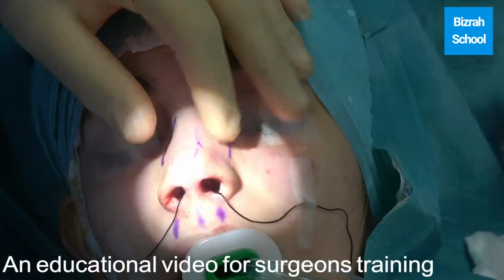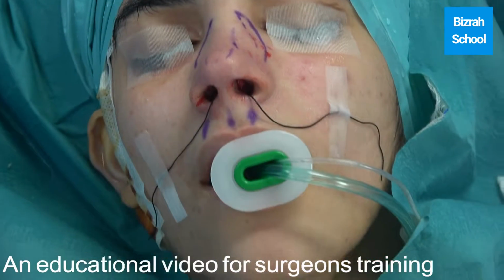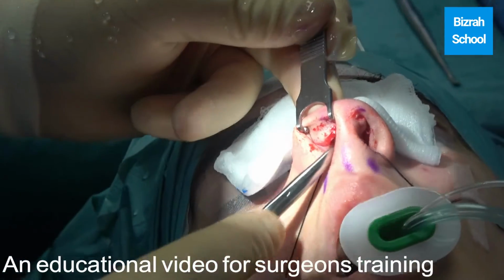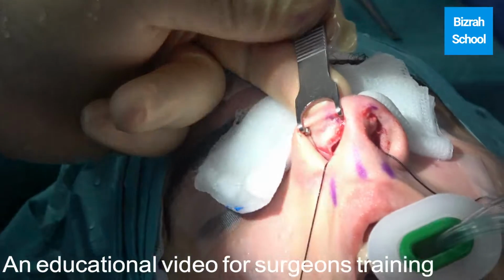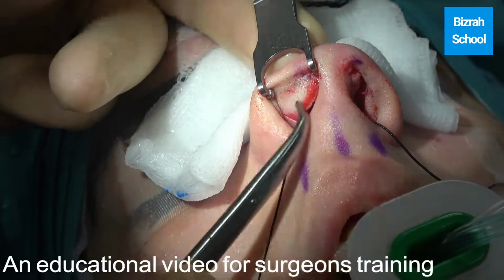Okay, it's very nice now, very nice and straight. We'll look at the lateral crus now, see if we need to do any more refinement. You see this lateral crus is kept intact, no marginal incision, no exposure, no delivery, and we'll not touch it. So we leave it, looks fine.